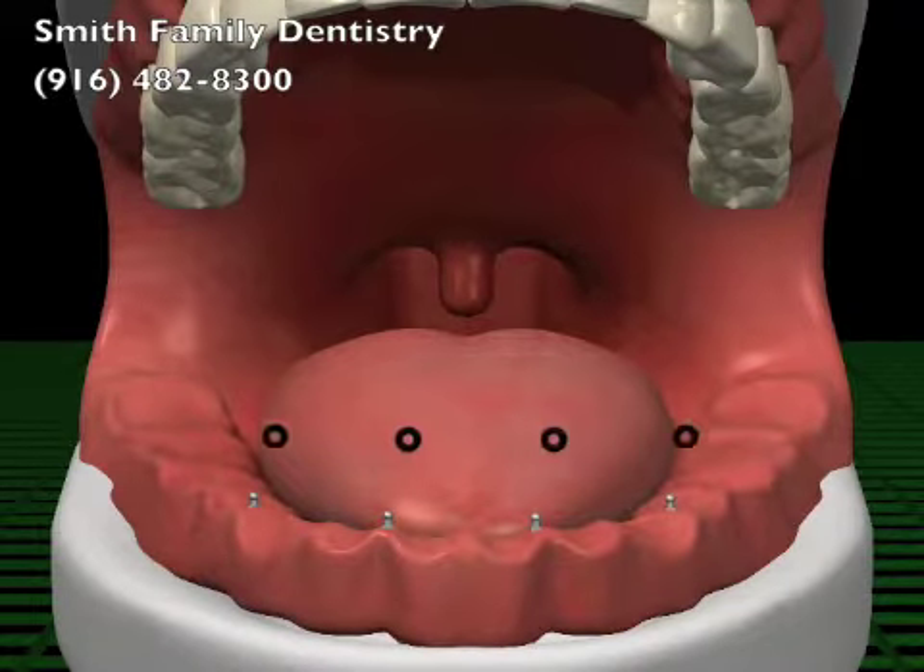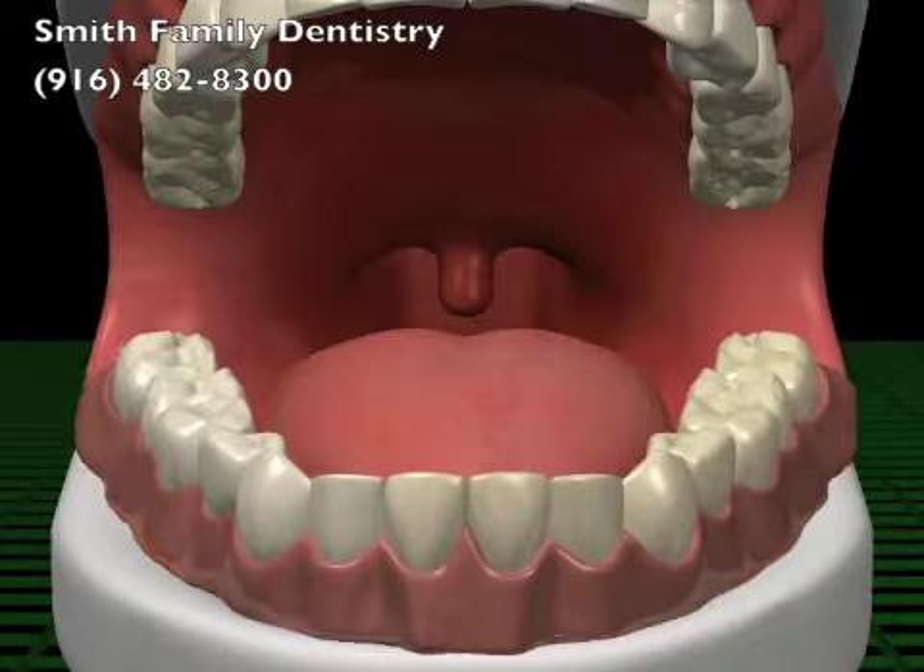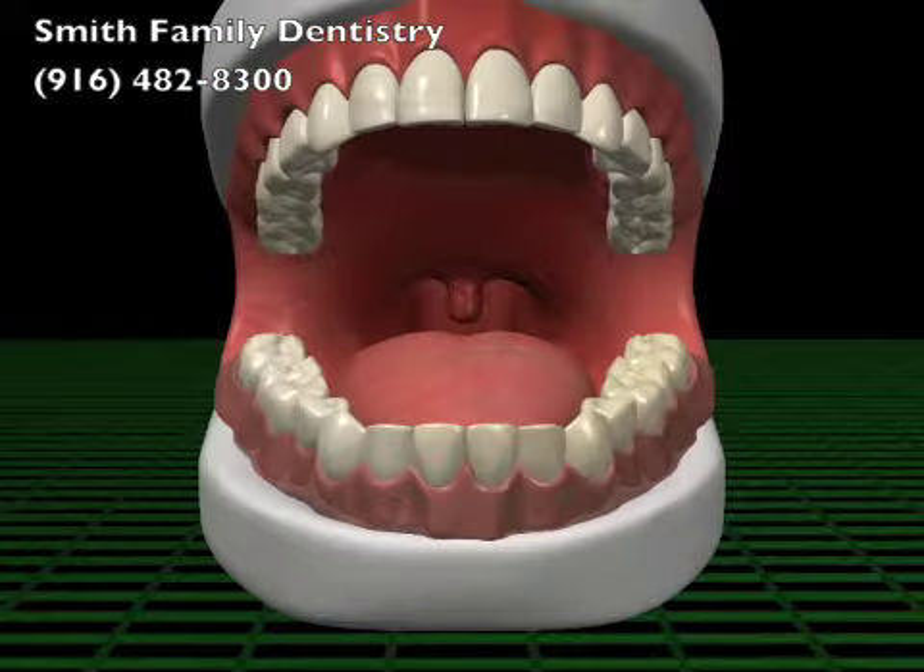Your denture snaps securely onto the head of the implant. Often your existing dentures can be used. The end result is a comfortable denture without the need for messy adhesives.